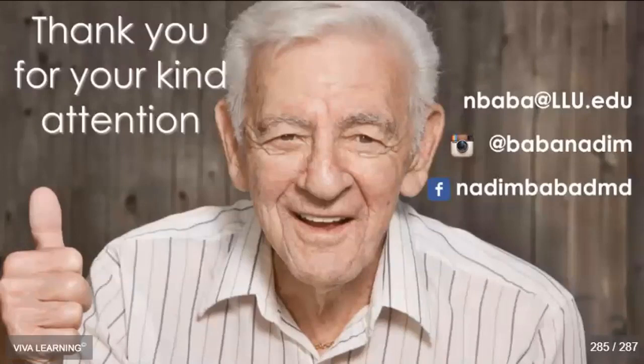Another question is, how do you repair a milled denture tooth? That's a very good question. The material is PMMA, and what you can do is use cold cure PMMA, the same shade of the teeth that have been milled, and you can adjust that. We've tried that. We broke a denture with a hammer just to see if we can fix it, and we found out that we can. Now, if the teeth are printed, forget about it. You will not be able to fix them. They need to be reprinted.